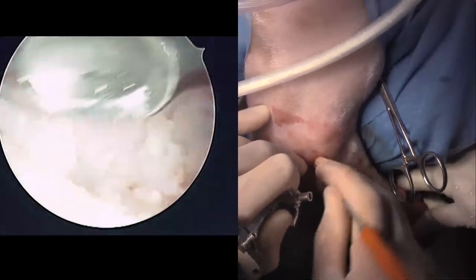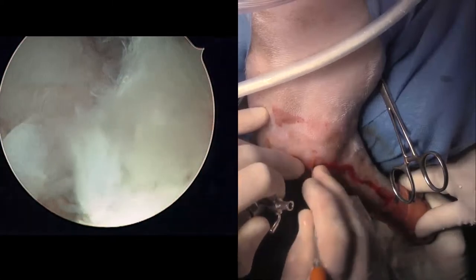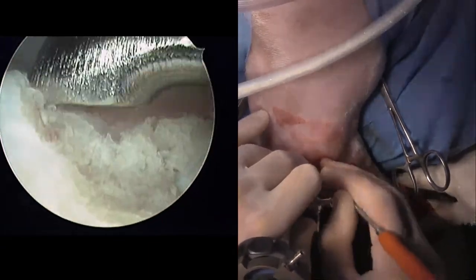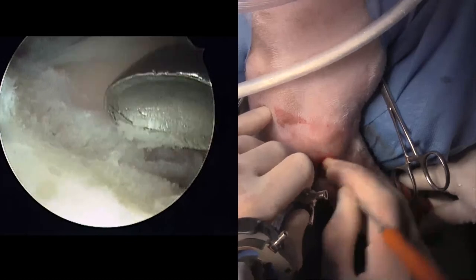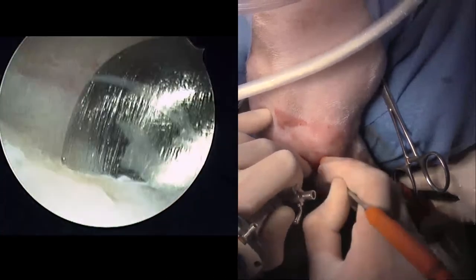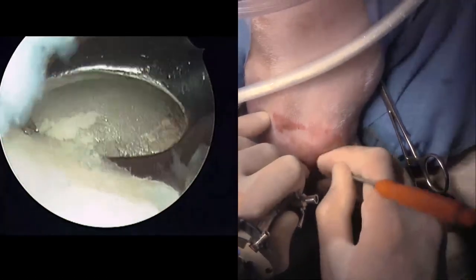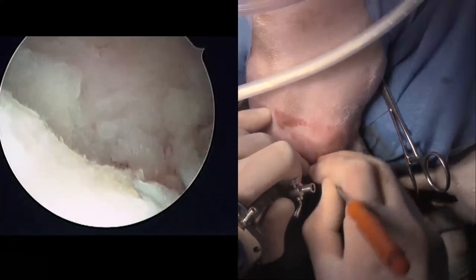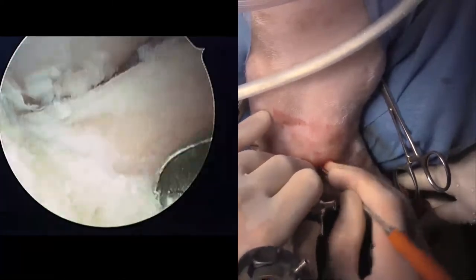Can we get some mepivacaine, please, and some 3-0 nylon? All right, so I'm just going to clean up that edge right there. So that's all coronoid process that I'm cleaning up. There should be super juice in there as well. All right, and that should be pretty much it.